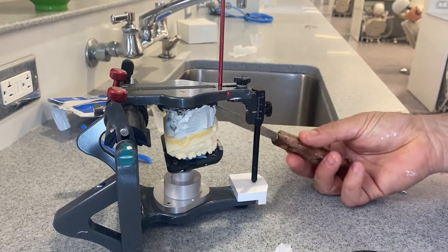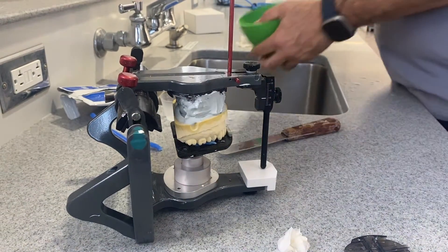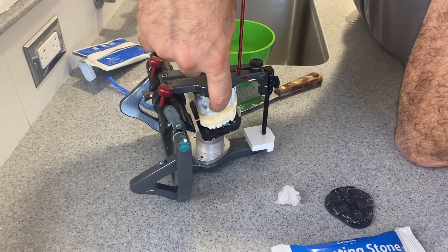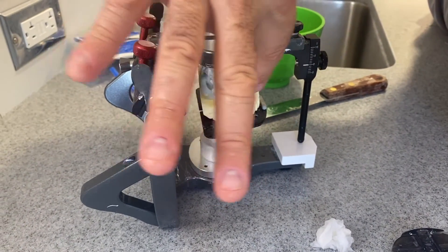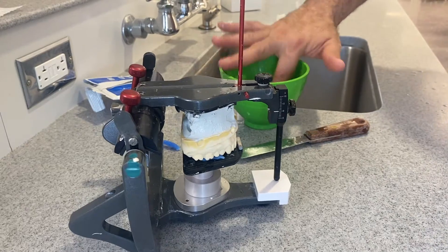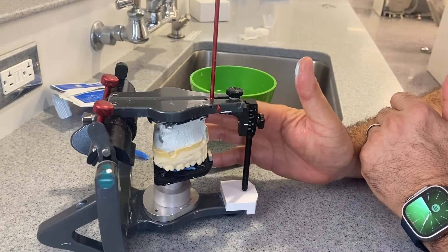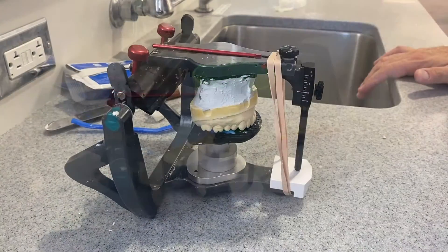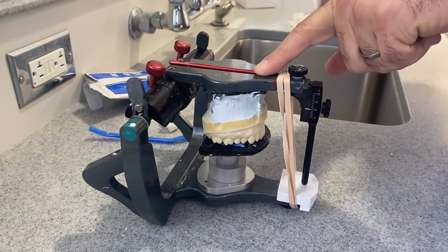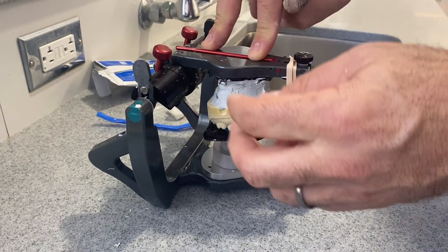Clean up the excess. Feel the stone — it's setting. You can use your hand and finger with water and just wait. After a few minutes, once the mounting stone has set, make sure you put some rubber bands to prevent expansion. Remember, these materials tend to expand a little bit.